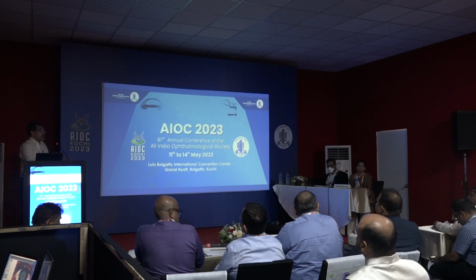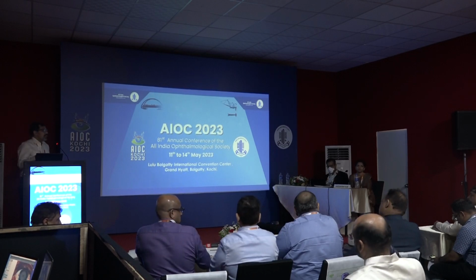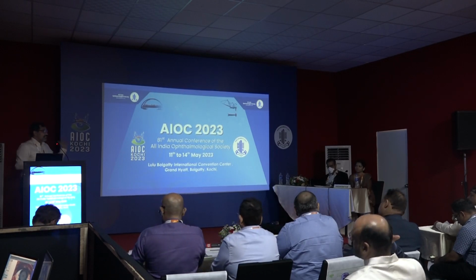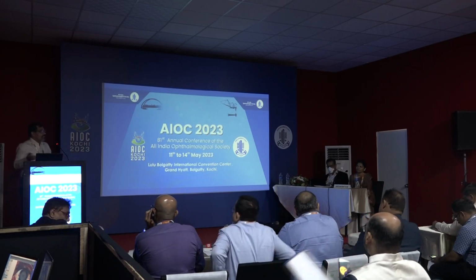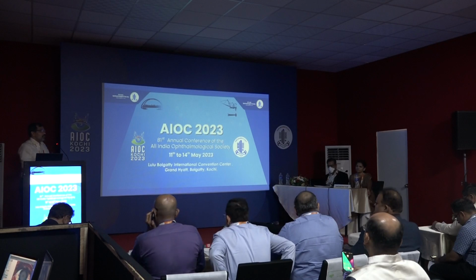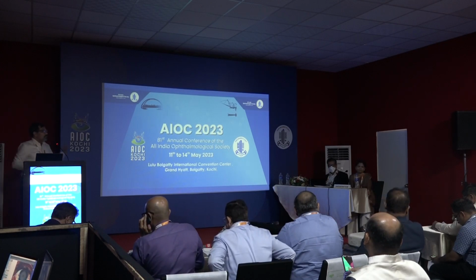So you can counsel your patient. Just by doing a topography, you can find if oblique astigmatism is there. Whether it is 1.1, how much the net astigmatism will be, you can directly get from here. So there is no need to fill in all the forms to see what the net astigmatism will be.